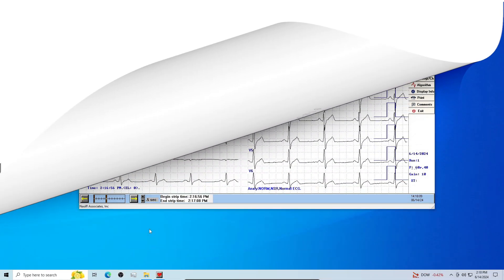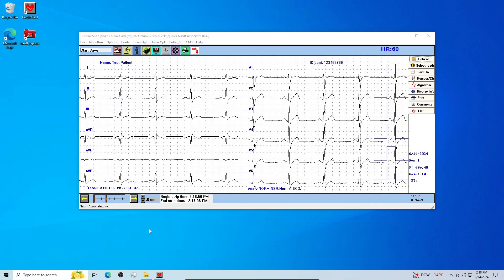Hello from NACIF Associates. Once loaded onto your computer, open the Cardiocard ECG software.